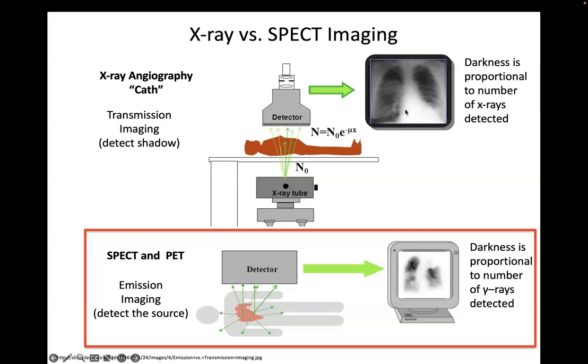you basically, in the old days when this was a silver iodide film, you would not expose the film. And so therefore you would get a very bright signal. And then where the X-rays got through and exposed the film, you get a dark signal. So it's a negative, essentially. And so this is a map of the absorption of X-rays through the different pathways through the patient.